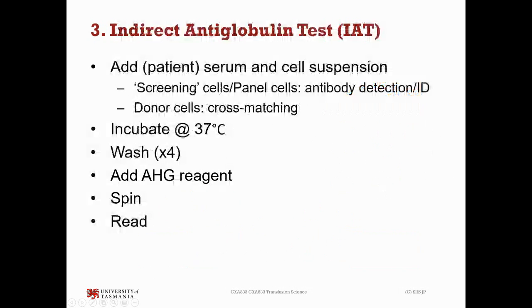The indirect antiglobulin test is exactly the same steps at the end here, but we've got a couple of additional steps before we get to washing the cells. Okay, the indirect antiglobulin test, we need to sensitize the cells ourselves. We don't start with sensitized cells.